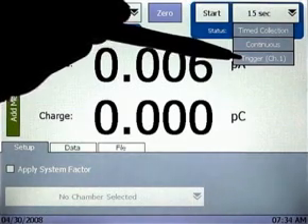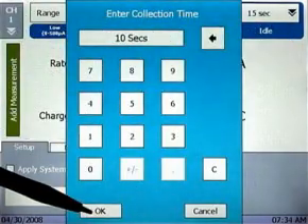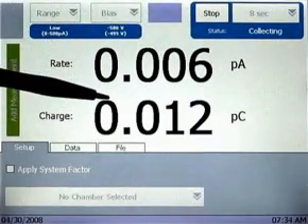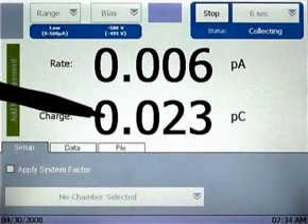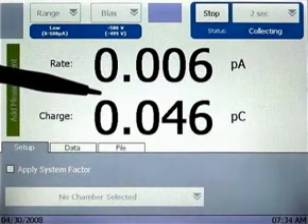For this example, let's perform a 10-second timed collection. Tap Start to begin. As you can see, the charge value is shown accumulating on-screen along with the rate or current value, and an audible alert sounds when the charge collection is complete.